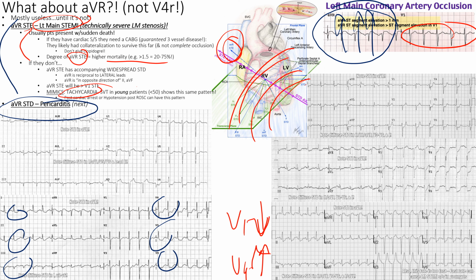So that's what requires an expert investigation, right? That is what ACLS tells us: just get someone involved so we can see, is there something more at work here? Okay, and they also recommend doing 12 leads about, I think they say 8 minutes, after an arrest, because if you do it immediately after arrest, you're going to see definite ST changes. But if you wait 8 minutes, that's more confirmatory.